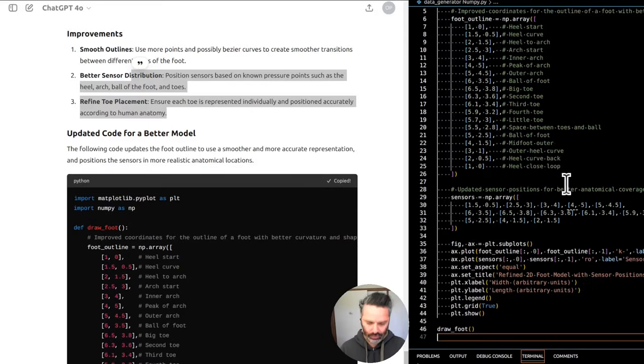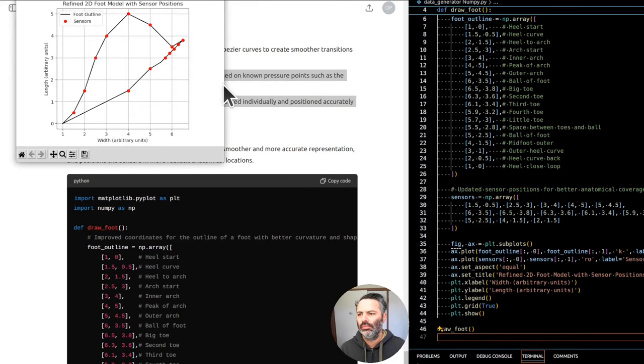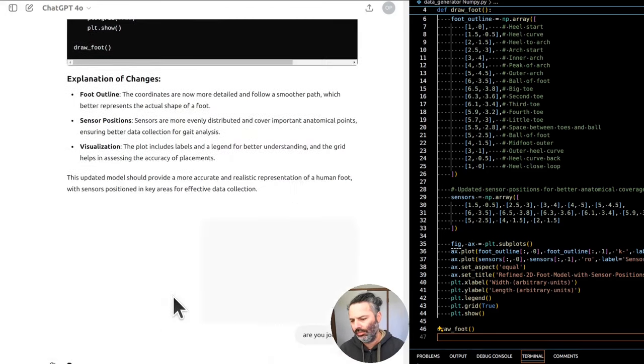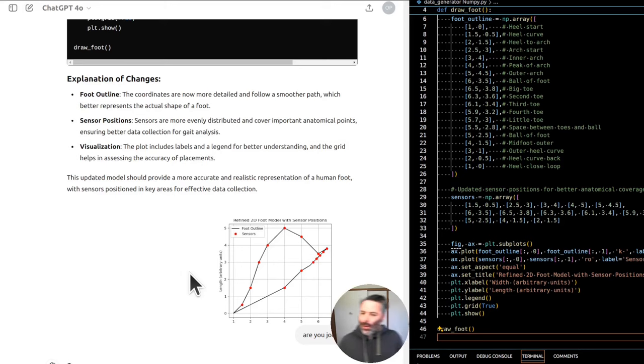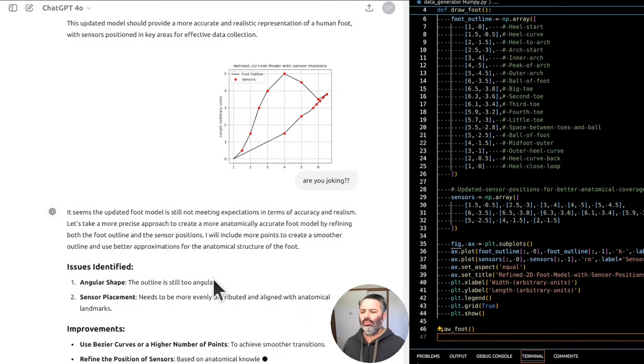Issues with the current model. 1. Shape accuracy. The outline of the foot is too angular and does not accurately represent the curved nature of a human foot. The heel, arch, and toes should have smoother transitions. 2. Sensor placement. Sensors are placed in somewhat arbitrary positions and do not fully cover key pressure points. For example, there should be better distribution around the arch and the ball of the foot. 3. Toe representation. The toes are not well represented in terms of individual placement and alignment. Each toe should have a more distinct and anatomically accurate position.